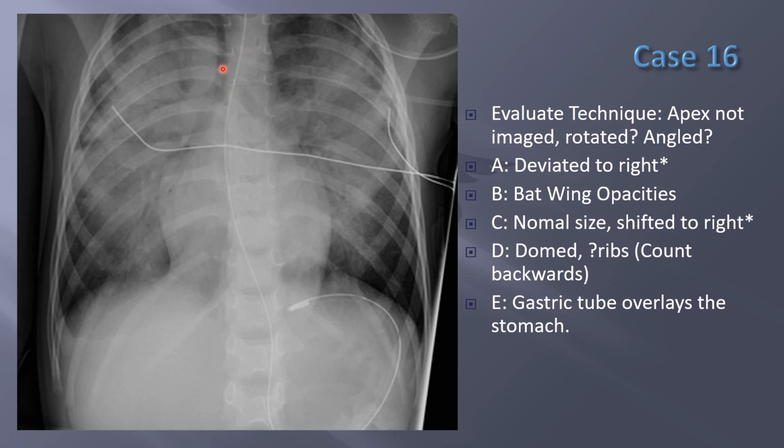There's markings on this tube. So I usually just aim about 55 to 65. If I start hitting resistance at 55, I kind of cool it, and then I'll put a stethoscope over the stomach here, and I'll push some air down the gastric tube with a syringe, and I can hear air escaping out of the tip here.